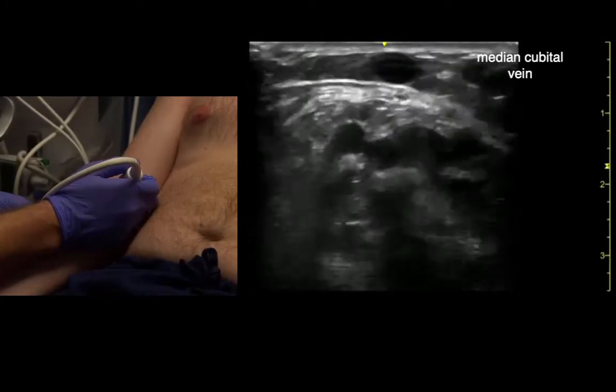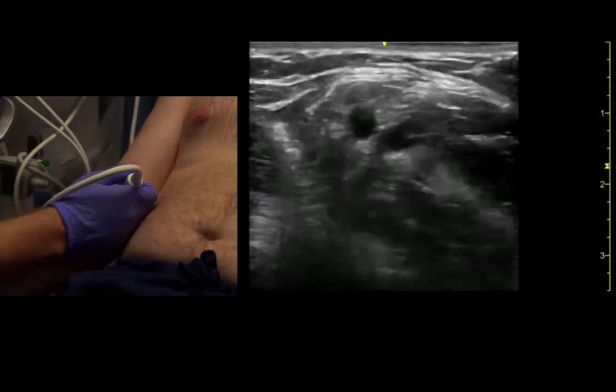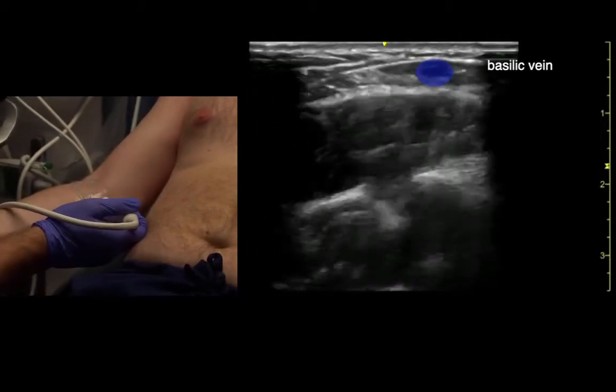That's the median cubital vein going over top, really superficial as well. And that leads us to the basilic, which is right there.